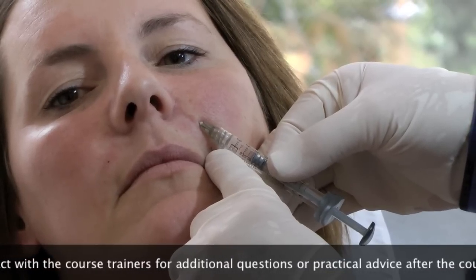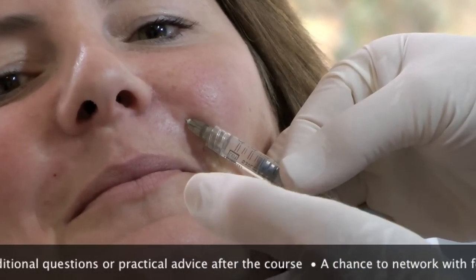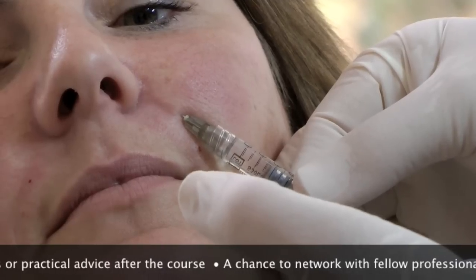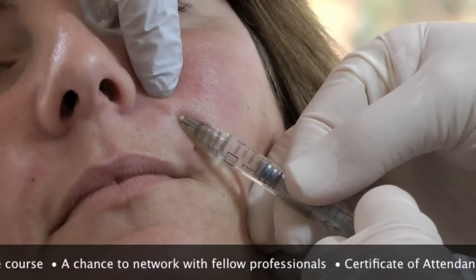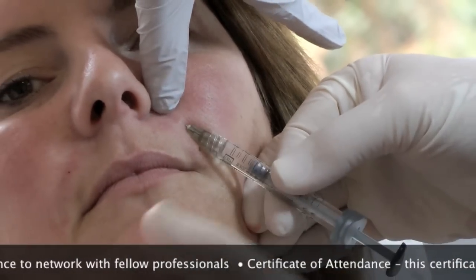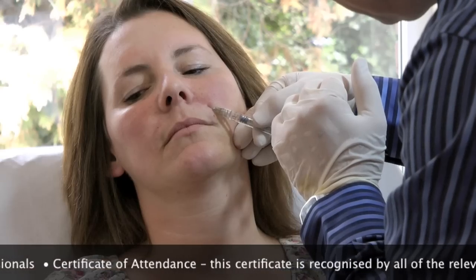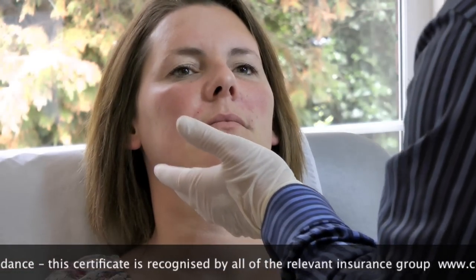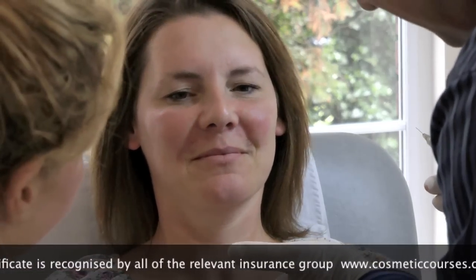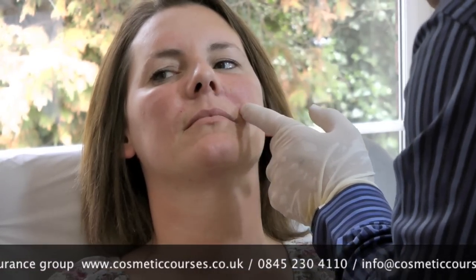So you asked about how many injections — this doesn't seem to matter after it's all numb, does it? Maybe you relax the face again. It's slightly more medial, just sort of there. Maybe a bit more in there, just to bring your eyes right.